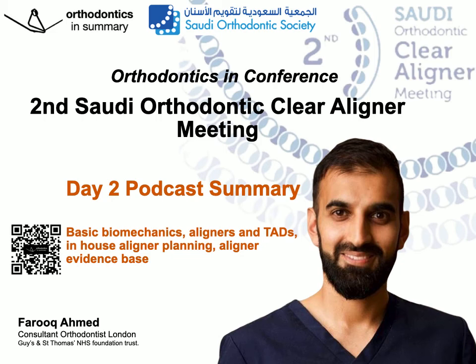He spoke about the accuracy of aligners to outcomes, and they range from 77% for tipping movements by Wheeler 2017 to 50% of overall tooth movements, which is in the paper from this year by Howley in 2020. He described how extraction of first premolar research has given more insight as to how aligners work. So he looked at a finite element analysis, and it showed that we get uncontrolled tipping of the upper incisors. That was by Jiang in 2020.